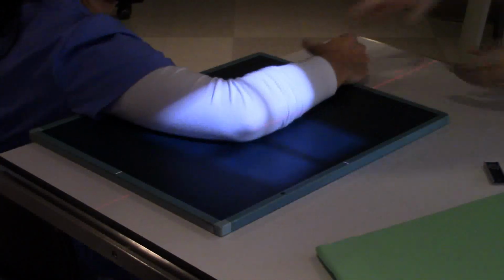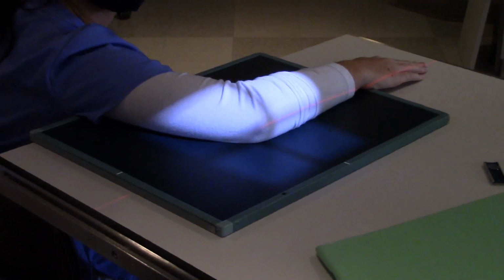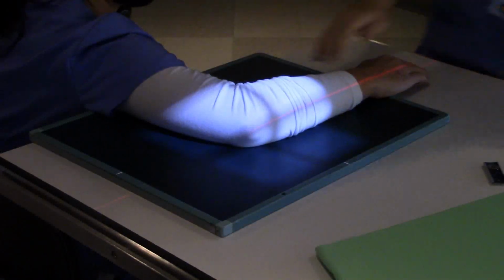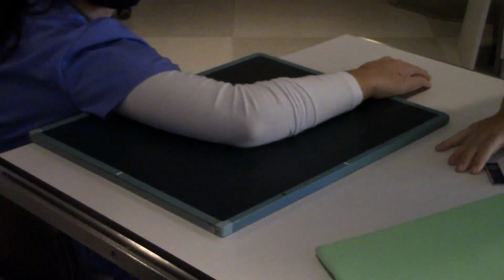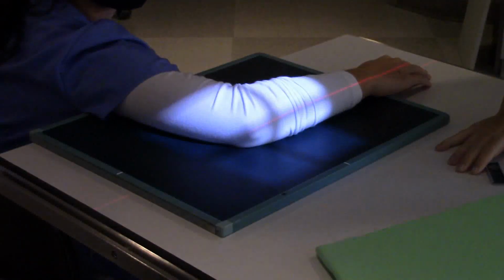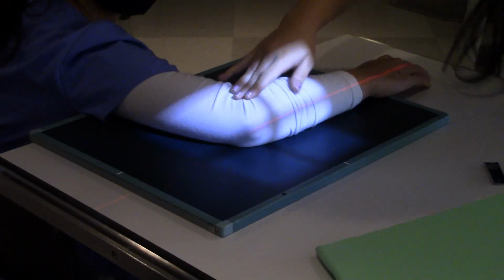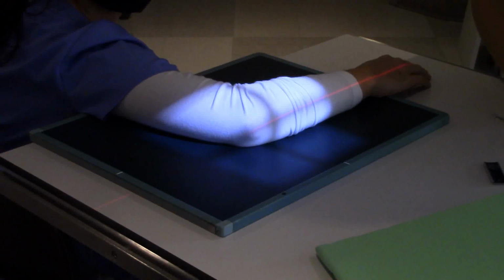And then she does this. Yes, the hand is pronated for this image. A nice 90. And then do you go in? Where's the center? Okay, the central ray is going to, remember how a few minutes ago when we did the lateral, we found that epicondyle and then went a little bit distal to it? We're going to do the same stunt again, but except for, you see where your central ray is?